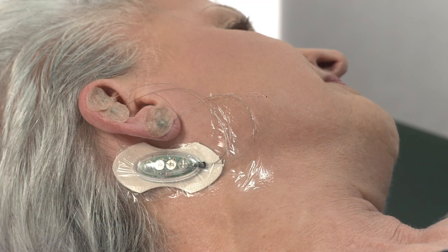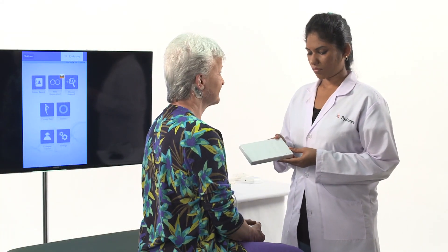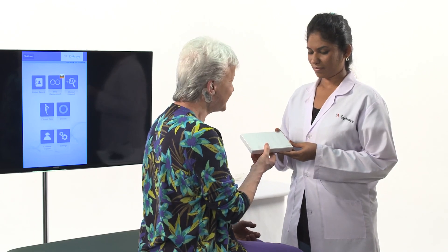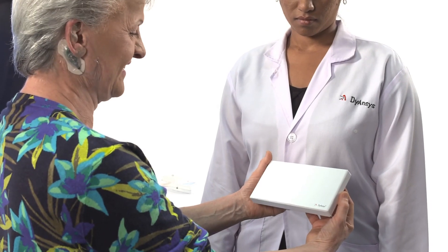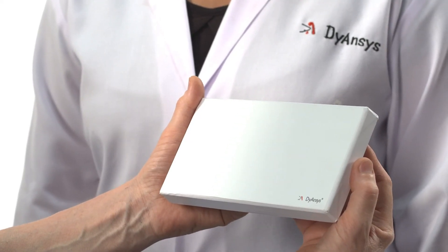Final Patient Instructions. Have the patient wait at least 15 minutes to assure they are pain-free and not experiencing excessive discomfort. During this time, present the empty ANSYSTEM box to the patient. The box contains test protocols including instructions to not wash their hair and keep the device dry while bathing. Remind the patient to be careful with the wires while grooming. Instruct the patient to notify the office of any problems during treatment. Tell the patient exactly when to remove the device — this is typically 4 days or 96 hours after placement. Schedule their next appointment.